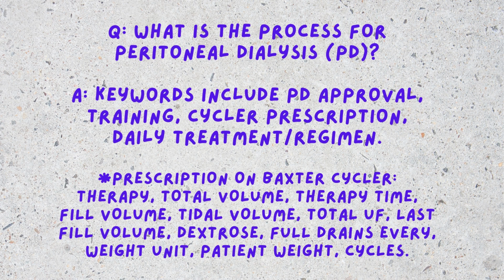But it's best to do it at least an hour or so before you start, because that way the fluid up top will have time to warm. At the top of the machine, just like the photo shows, where that bag sits, there is a warmer there that warms the fluid, so it doesn't go into you cold, it goes into you warm. Some machines also have memory cards, and you record some of this, and then you bring the memory card with you to your appointment. Some machines also offer that option.